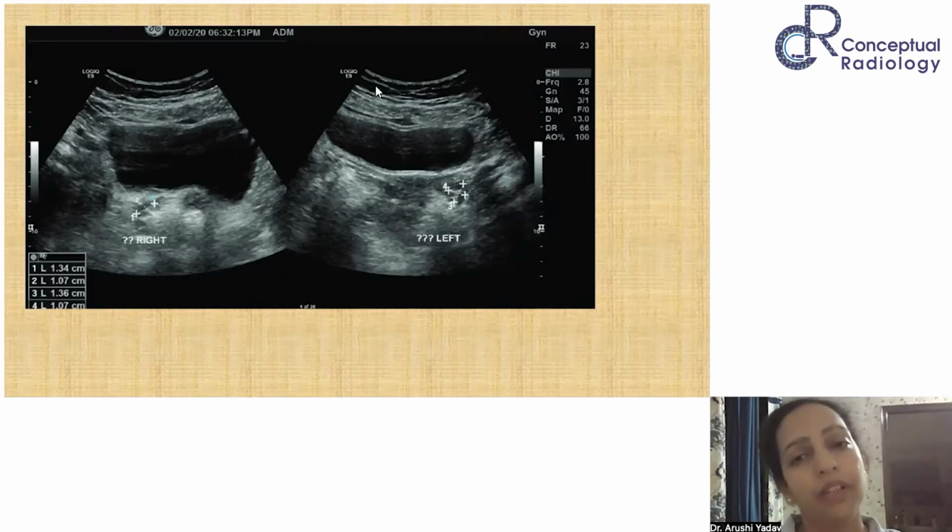So any clues where we are heading to? What would you like to put up in your report? Streak ovaries, very good. And streak ovaries and? So what would you like to see in the patient morphologically? Turner's, very good. What are the features of Turner's? What would you like to see morphologically in that patient?